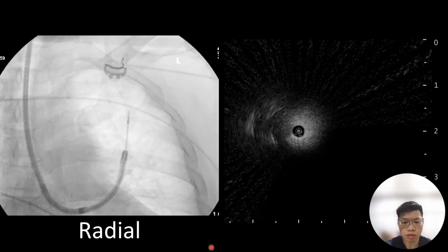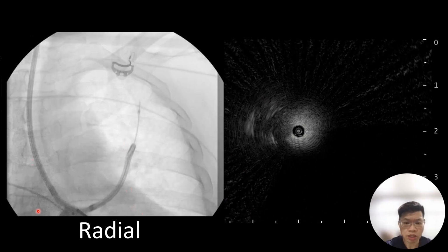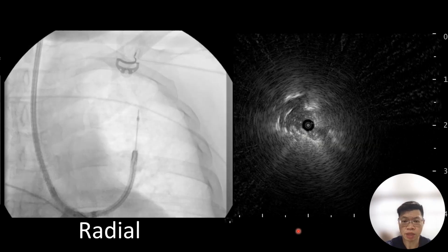Here you can see the radial on fluoroscopy producing an eccentric image. You can see that I have extended the bronchoscope such that we'll be able to make passes into the inferior aspect of the airway wall. And after 3 passes, we have created a track through which we can repeat our radial EBUS, and that produces a concentric image. And this signifies that we have successfully converted an eccentric nodule into a concentric nodule, through which we can carry out our biopsies.